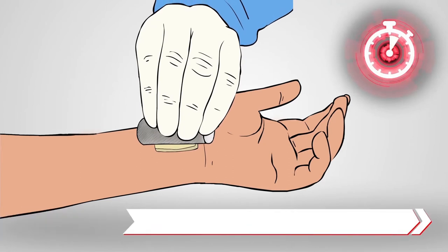Remember, once applied, do not lift or remove Axiostat for at least 30 minutes, not even to check for hemostasis as it could cause re-bleeding.